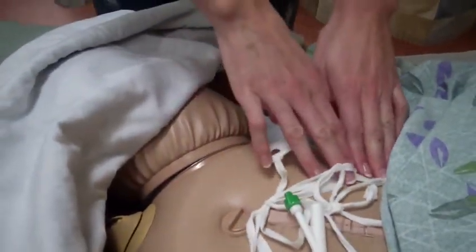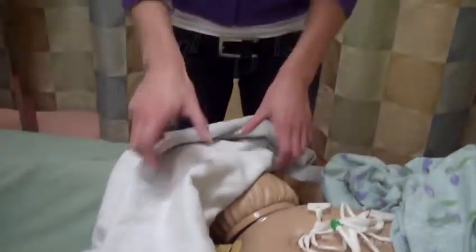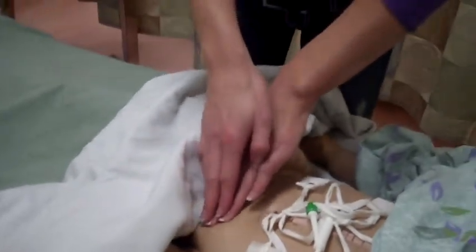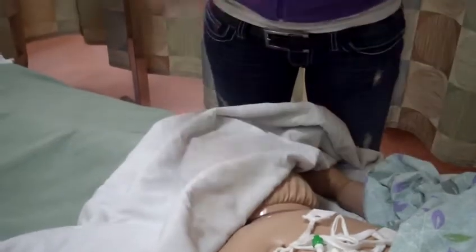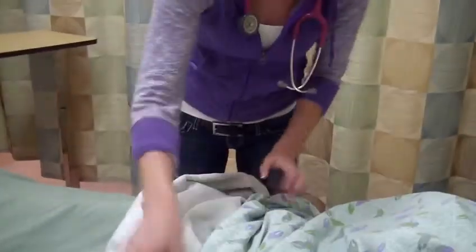Next we're going to lightly palpate the abdomen, and we're seeing if she has any tenderness or any masses can be felt, and everything feels good. So since we're going to insert a catheter in her, we're also going to palpate the bladder, and it is distended, which indicates that she does indeed need the catheter. So we're just going to cover her up there, and I'm going to set this aside.